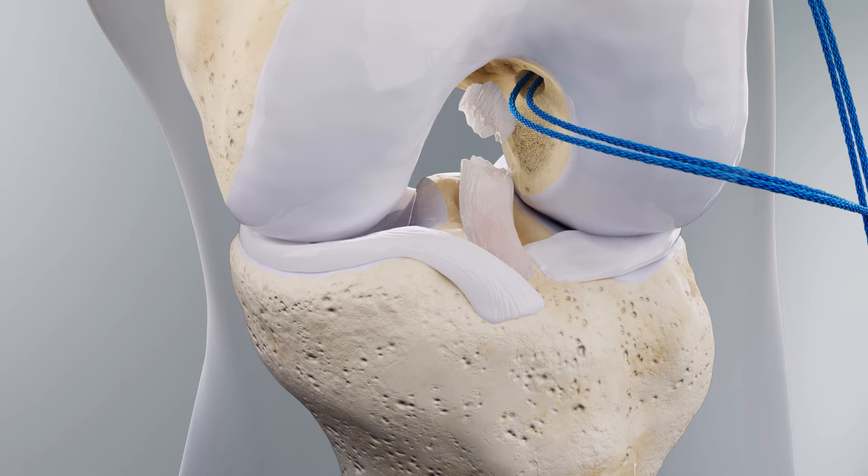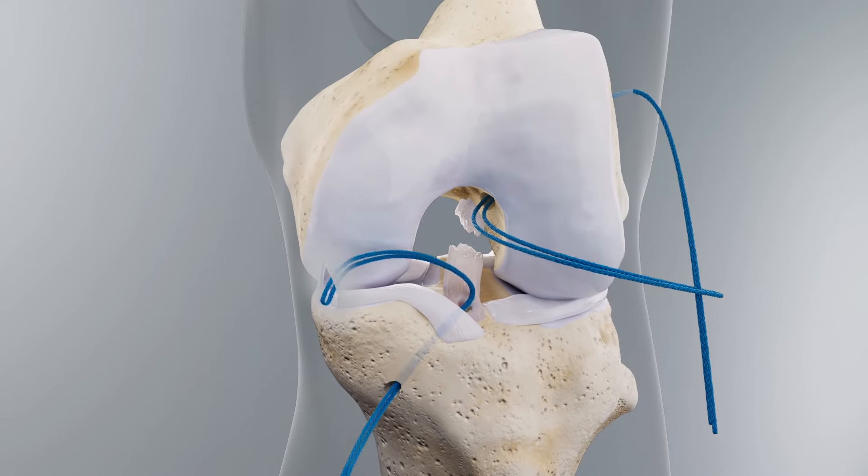The tibial tunnel is drilled by placing a tibial aimer so that the guide pin exits 2–3 mm into the central anterior edge of the tibial footprint and between the tibial spines. Follow this guide pin with the corresponding fixation button drill and reamer. Place a passing suture through the tibial tunnel.